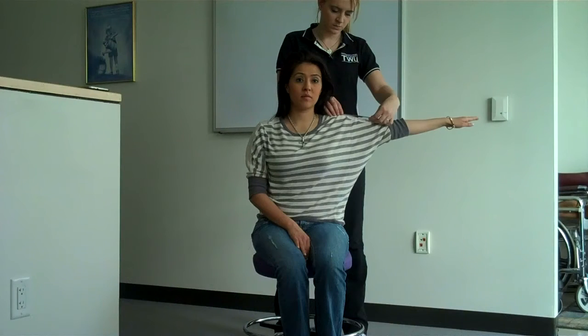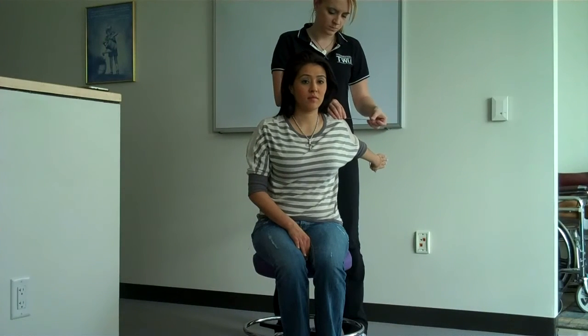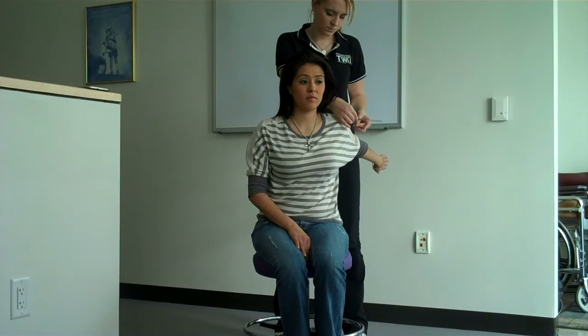on the superior axis. The client's arm is moved towards the back of the body in the horizontal plane of movement. Measurement begins at 0 degrees and ranges to 40 degrees.